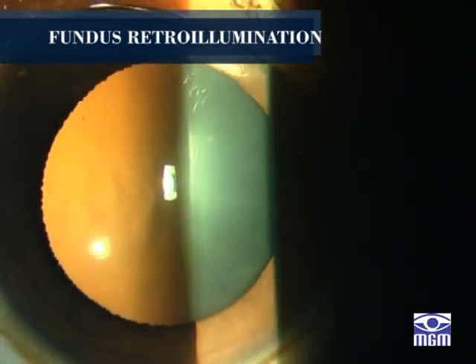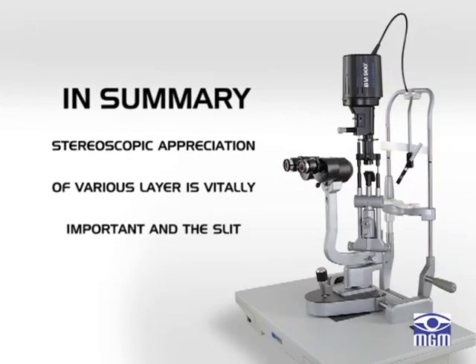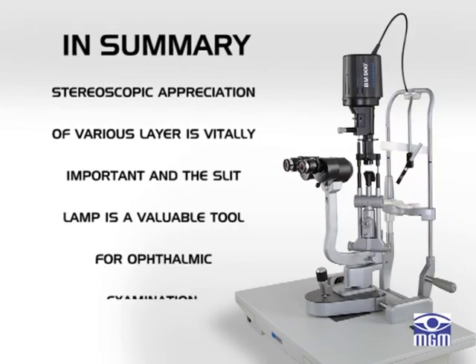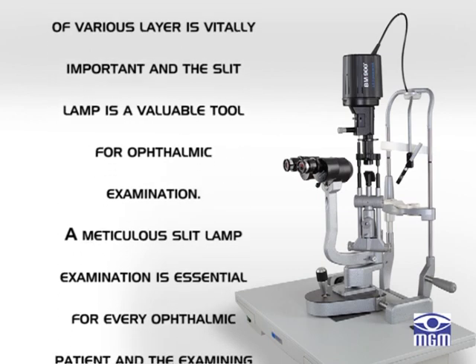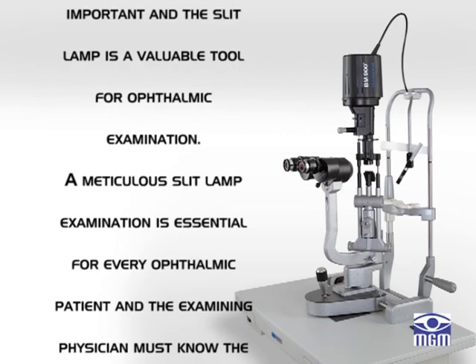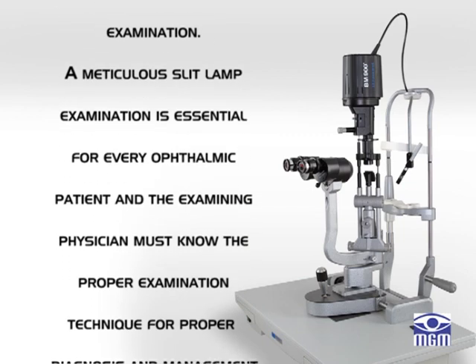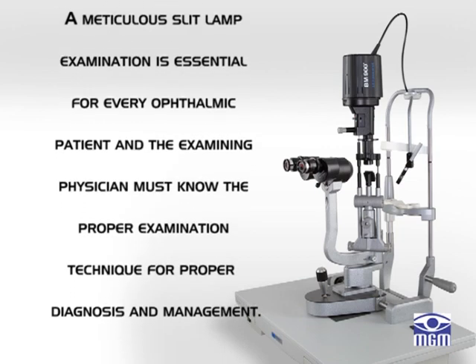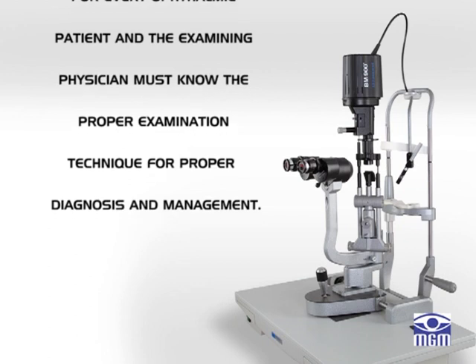In summary, stereoscopic appreciation of various layers of the eye is vitally important, and the slit lamp is a valuable tool for ophthalmic examination. A meticulous slit lamp examination is essential for every ophthalmic patient, and the examining physician must know the proper examination technique for proper diagnosis and management.